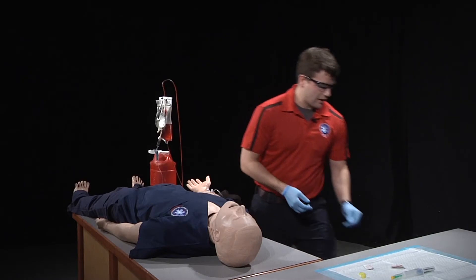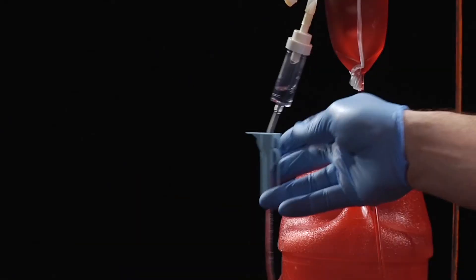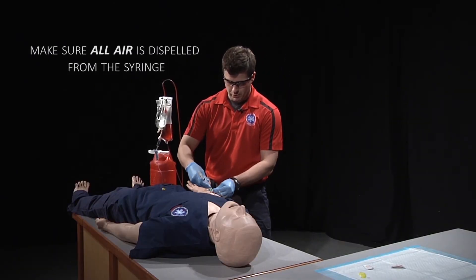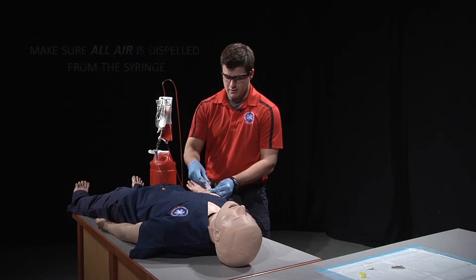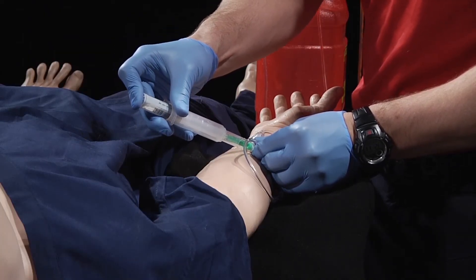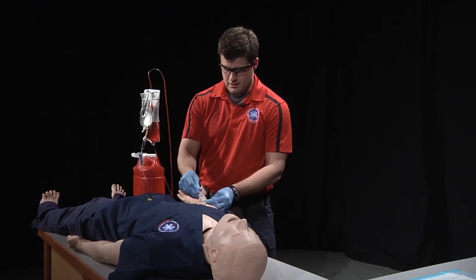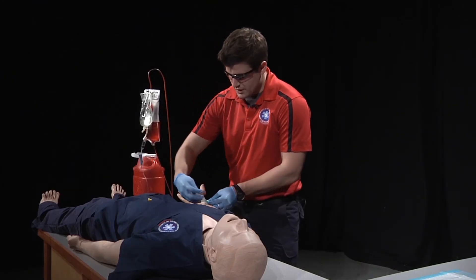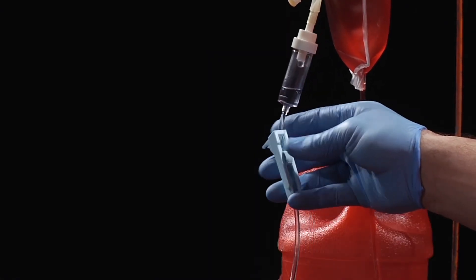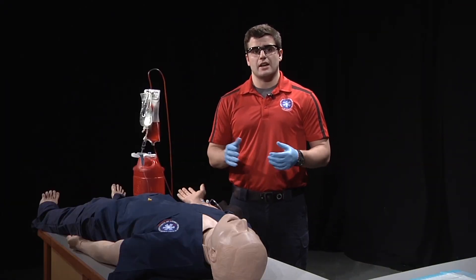After cleansing the port, we're going to come back and reconfirm our medication. We're going to close off our IV line, administer the medication at the appropriate rate, immediately dispose of the syringe, open back up our IV line to a TKO rate, and monitor our patient for adverse and desired effects.